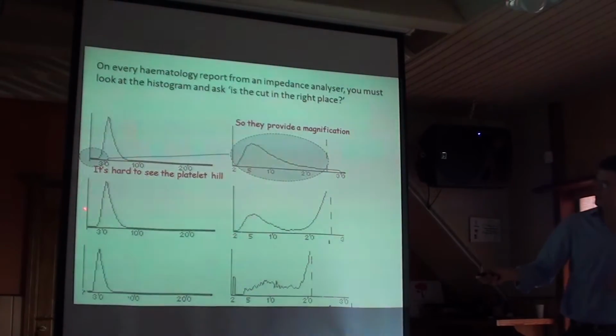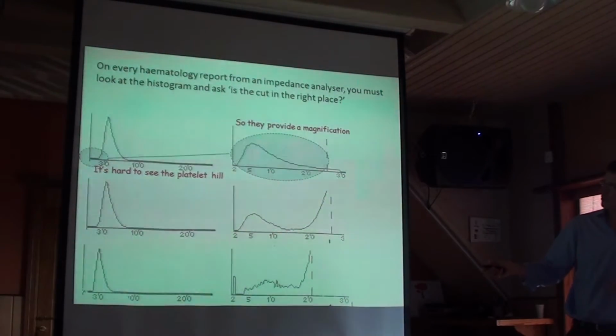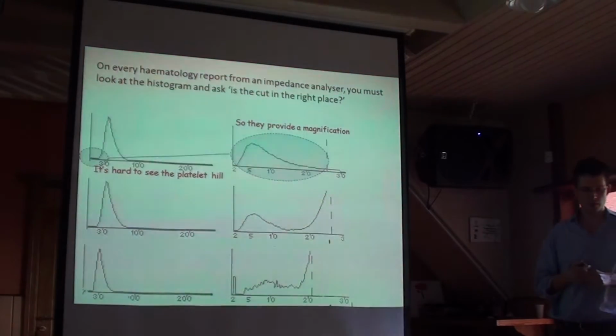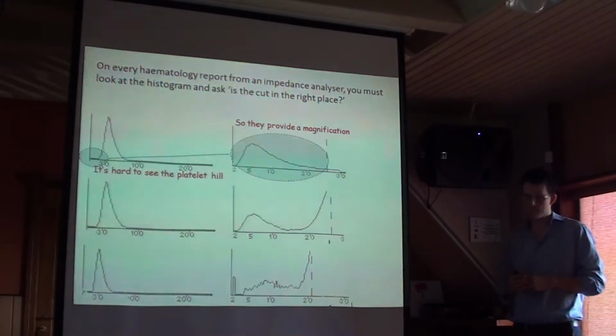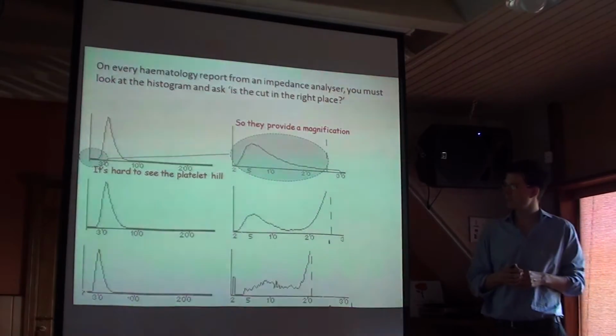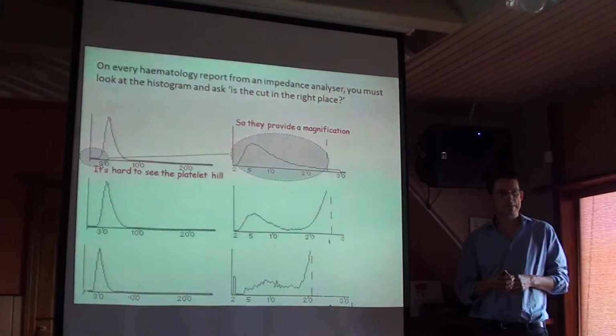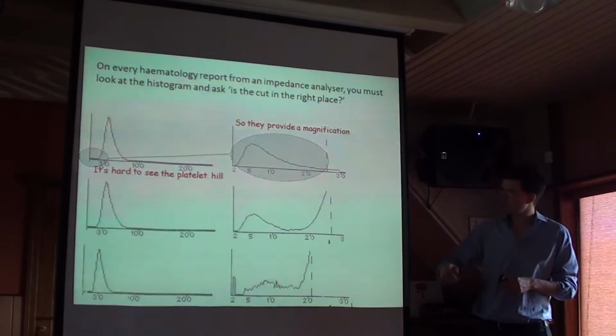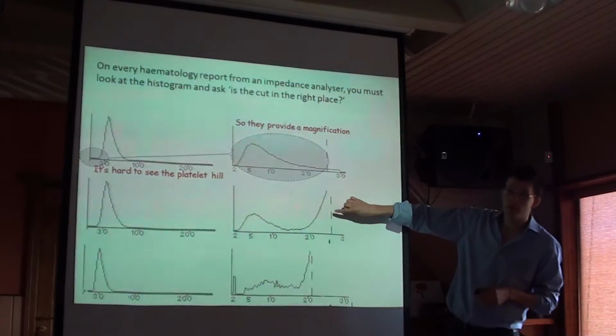So please have a look at this first patient here and tell me whether you think the count of platelets is going to be overcounted or undercounted. Kui vaadata nüüd seda keskmist graafikut, siis ta palub öelda, et kas teile tundub, et verelistakute arv on alahinnatud või ülehinnatud. Overcounted.